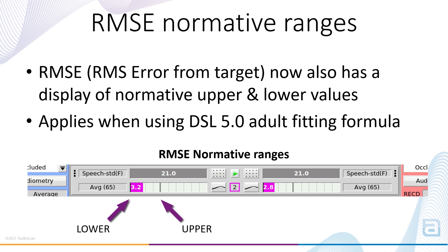Again, these show up as upper and lower limits indicated by thin black lines. Note that while SII is typically better with larger numbers, RMSE results are more favorable when the value decreases. In this example you'll note that the lower limit shows up right at the zero line.